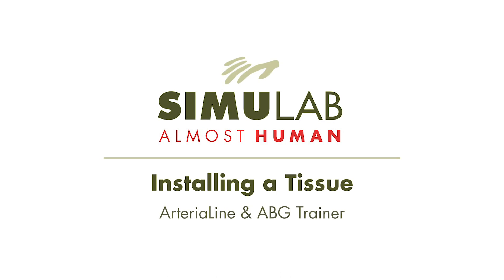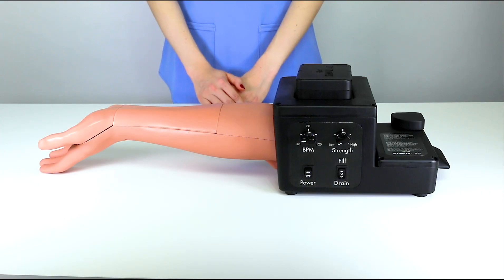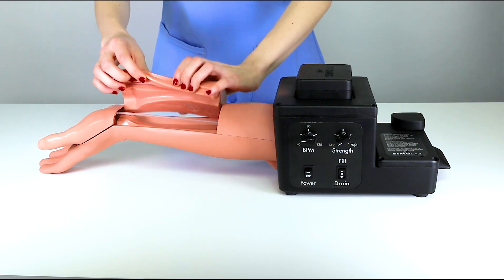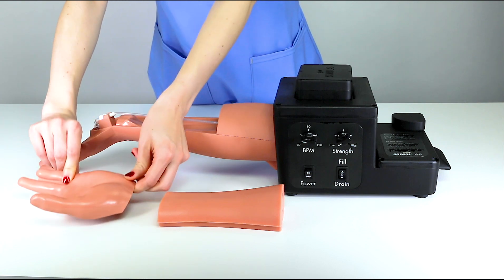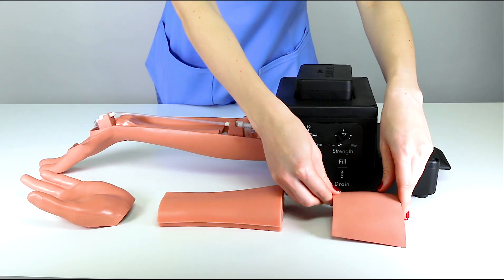Installing a tissue on the Simulab arterial line and ABG trainer. Proper installation of the replaceable tissue is critical to successful simulation of the radial pulse, arterial line placement, arterial blood gas sampling, and ultrasound imaging.